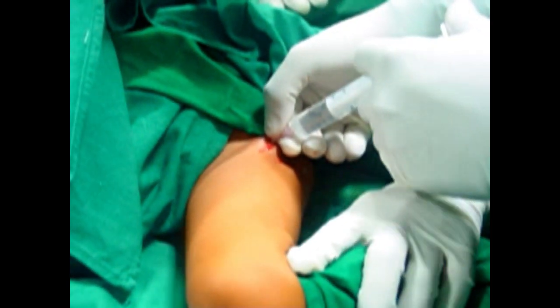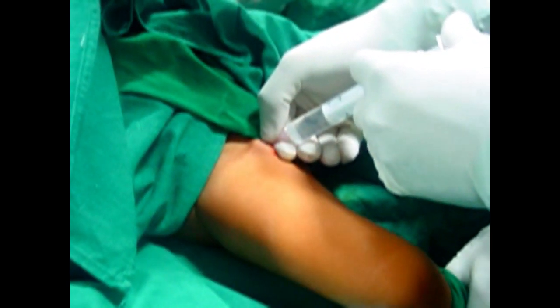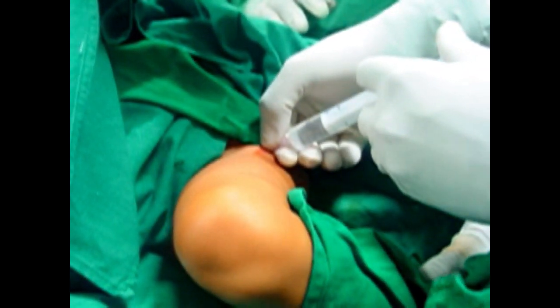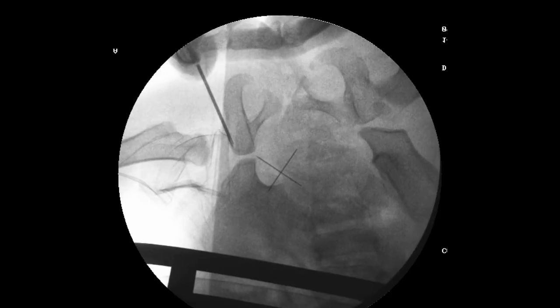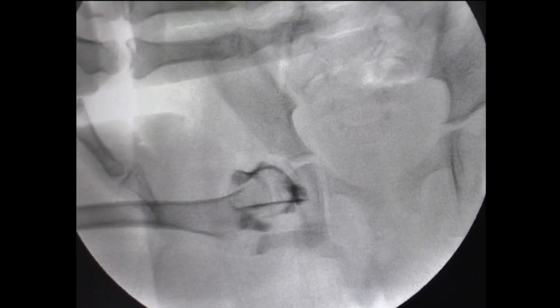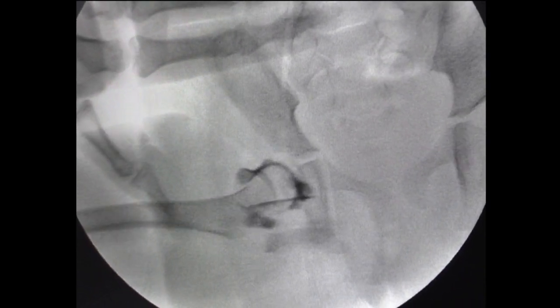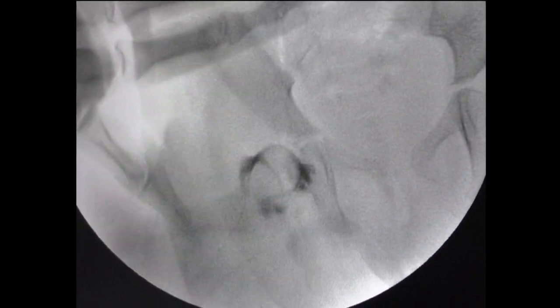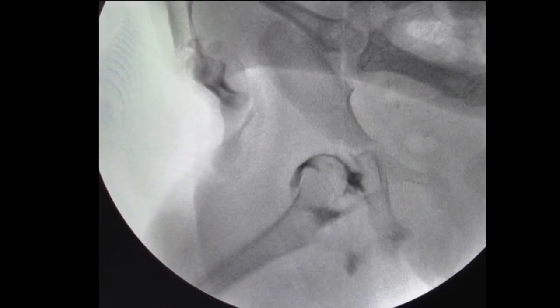If the fluid comes back out, and as you inject if the hip moves, it tells you that you are inside the joint. Now you are ready to inject the dye — I use Omnipaque. Then you take the hip again and check the safe zone of Ramse, abducting so that the reduction is stable.